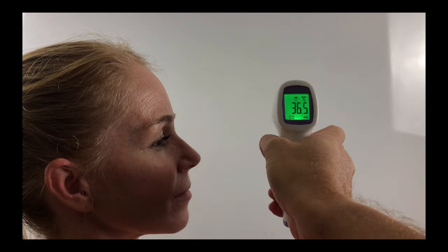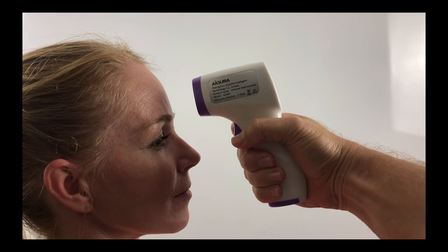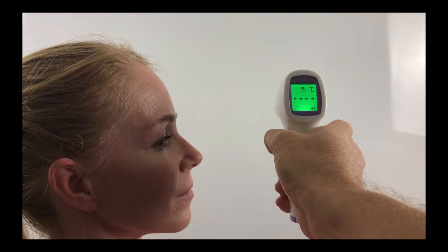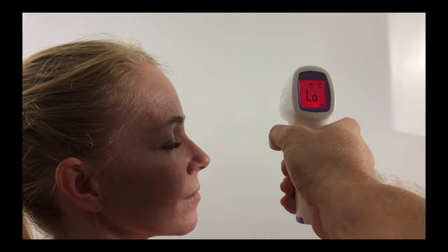An accurate sample will give you a green reading. When the sample taken is incorrect, it'll indicate low.